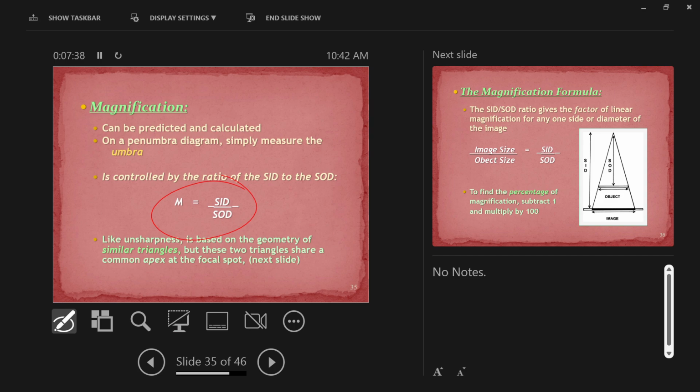A lot bigger, right? Why was the second hand's metacarpal so much larger? What did I do in this second image that changed that so much? I brought the source of radiation closer. So we had a small source to object distance. And what else did I say I did? The object to image distance, right? It was elevated. This image 2 is so much bigger, so magnified, because I had a large OID and a small SOD. Okay? Image number 1 was not that magnified.